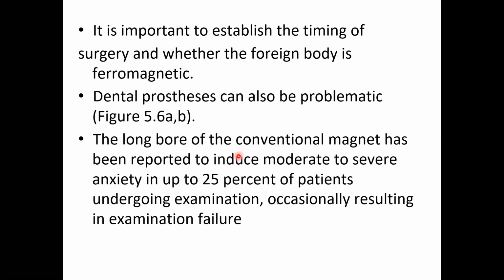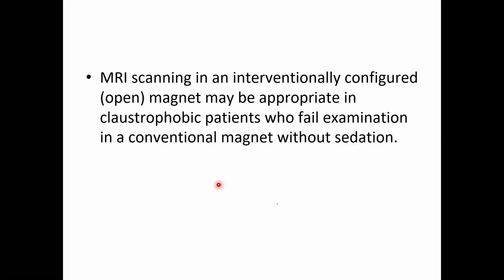The long bore of the conventional magnet has been reported to induce moderate to severe anxiety in up to 25% of patients undergoing examination, occasionally resulting in examination failure. So it induces some amount of anxiety, and it also affects anxiety neurosis patients. In 25% of patients, it leads to movement artifacts. An interventionally configured open magnet may be appropriate in claustrophobic patients who fail examination in a conventional magnet without sedation.